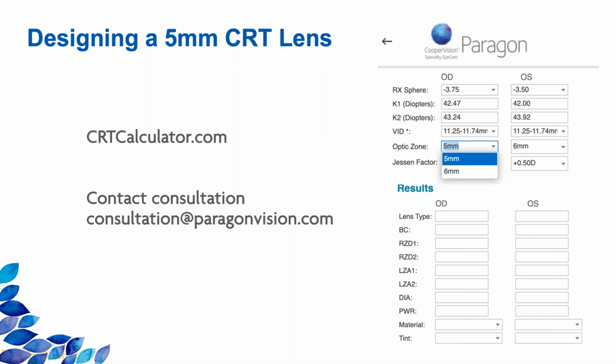If you are interested in designing a 5mm optic zone diameter lens, you can visit crtcalculator.com, and you'll see the calculator that is on the right-hand side of your screen right now. These are the same entry parameters if you're used to using our prior calculator, requiring the RX sphere, the K values, the VID, and then the optic zone will automatically be set to 6mm, but if you use the drop down, you can change it to 5.